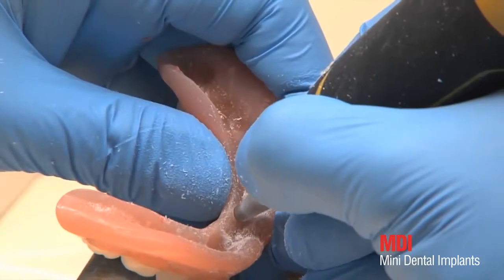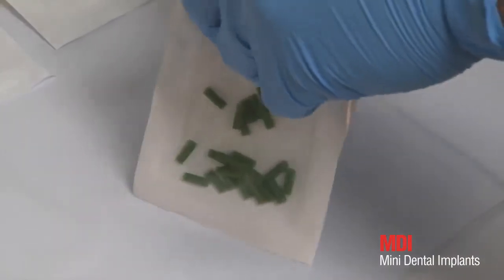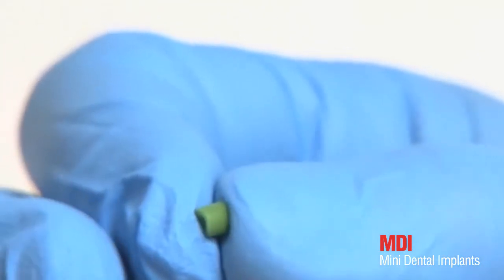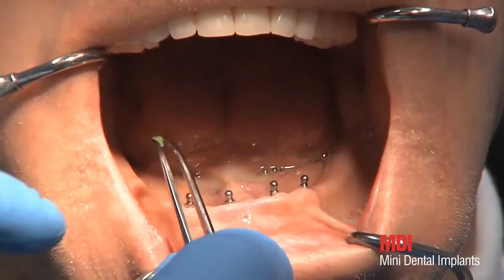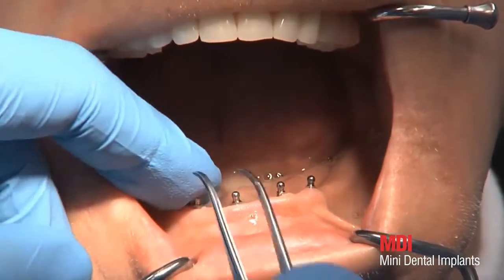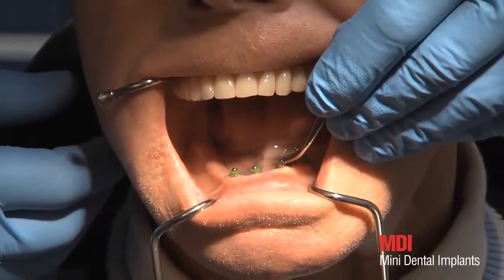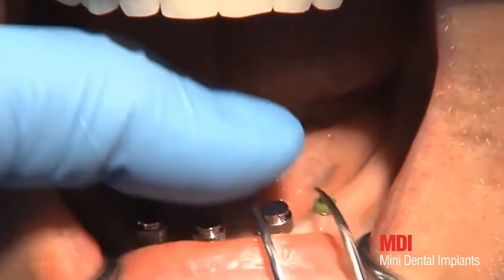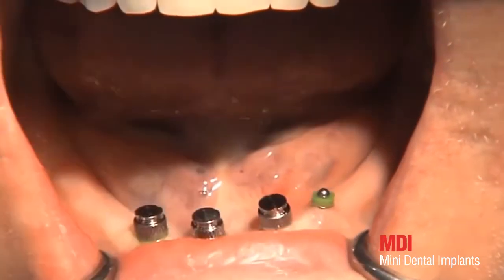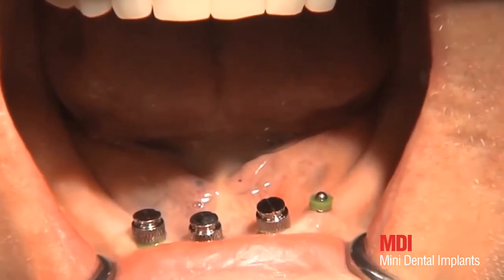Once a tension-free fit has been achieved for the entire prosthesis, it must be ensured that no prosthetic resin is able to flow under the metal housings during polymerization. So-called block-out shims made of silicon are cut to obtain small rings. Their height should be no greater than the distance between the gingiva and the metal housing. Now the silicon ring and the metal housing are fitted; if correctly seated, it should be possible to rotate them easily.